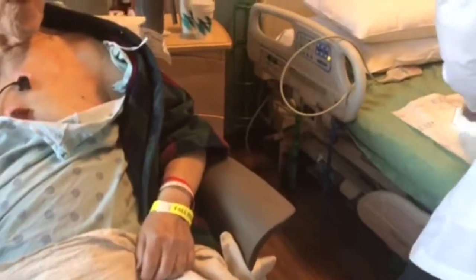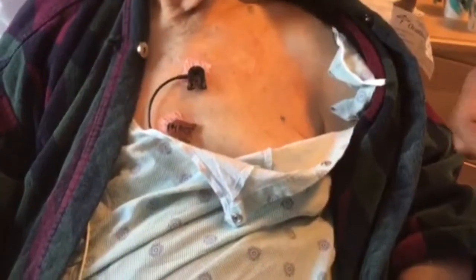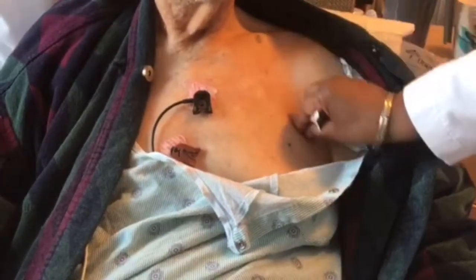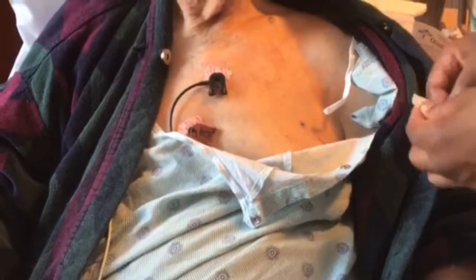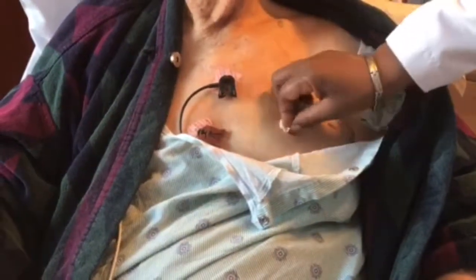First, you want to clean the area with a little alcohol so that the adhesive pad that holds the monitor in place will stick. The heart monitor you're going to wear for a total of two weeks. Each patch placed on here will stay on for seven days. The patch I'm putting on right now will stay on for seven days and will get changed when you come back for your post-op visit in a week at the doctor's office.